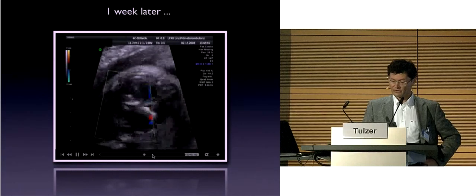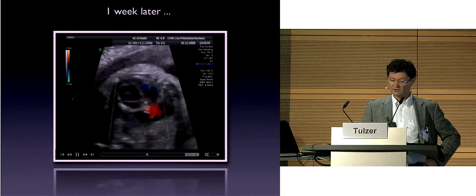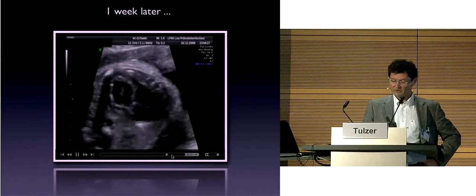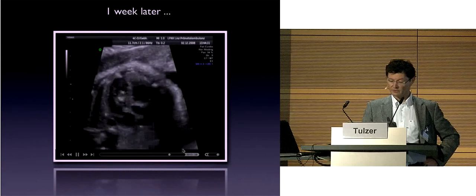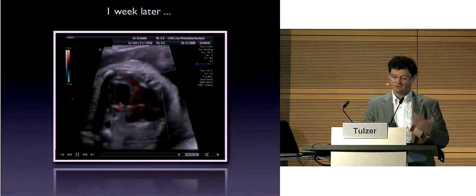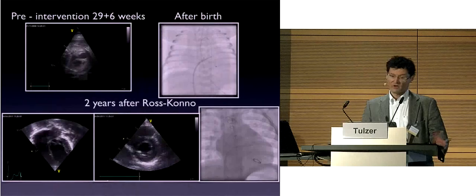Now we've crossed the aortic valve. You can see the balloon in the aortic valve with the aortic regurgitation, dilated the valve a couple of times and then pulled everything back out. Now the aortic valve is moving a little bit better, and you can see this flow through the aortic valve with some degree of aortic regurgitation.